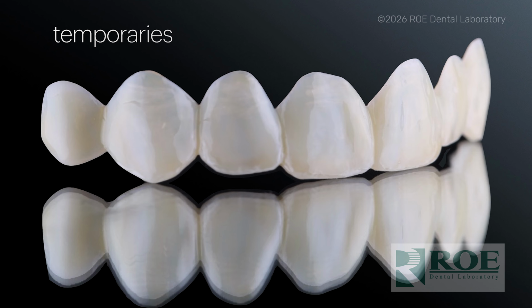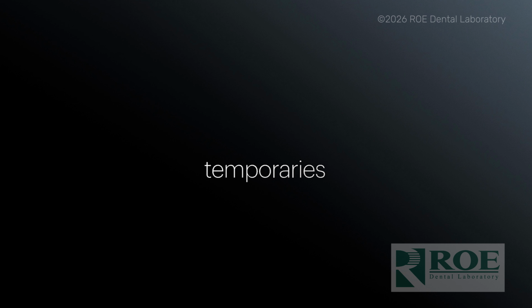But we need to understand that I truly don't think that these are temporaries, because when we start talking about temporaries, temporaries are just placeholders. They fill a space. That's why every time we do the bisacryl temporary and we grind it out of occlusion, inevitably the tooth above it super erupts. And then when we get a crown, the occlusion's off or the contacts are off.